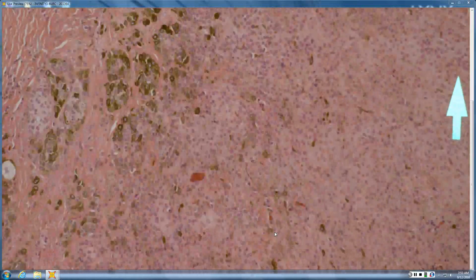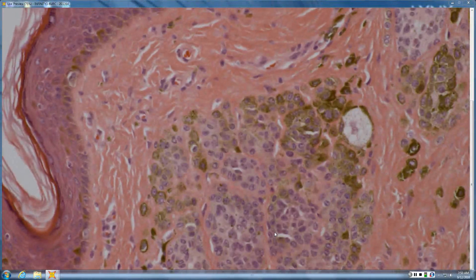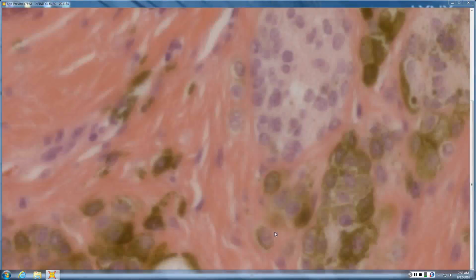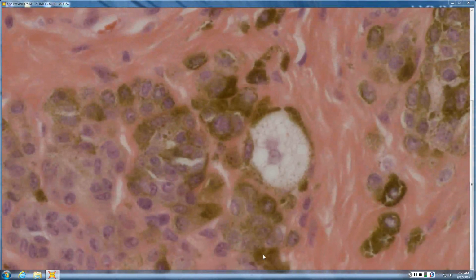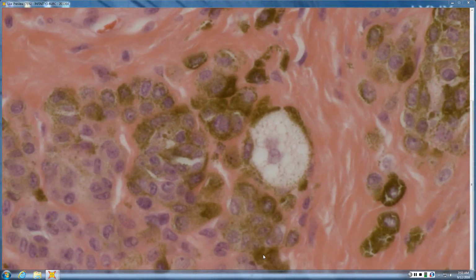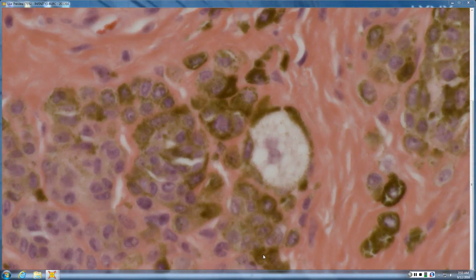No, I can't find it. This one was cut. Right in here. You see a few. See how these things almost look like sebocytes? Mm-hmm. It's just swelling of melanosomes. It's a degenerative change similar to a balloon cell nevus. So it looks very much like a sebocyte. You tend not to have a scalloped nucleus, but not all sebocytes show a scalloped nucleus.